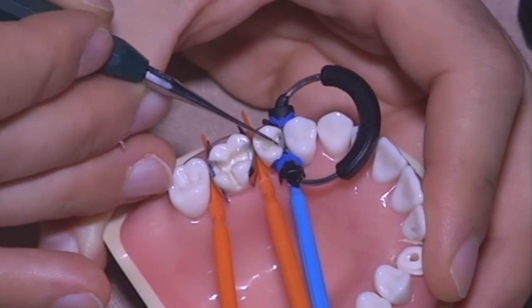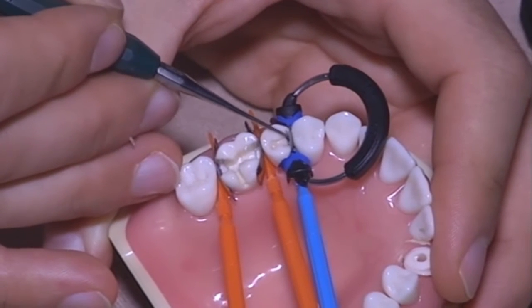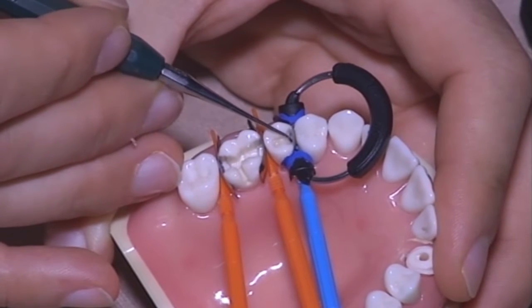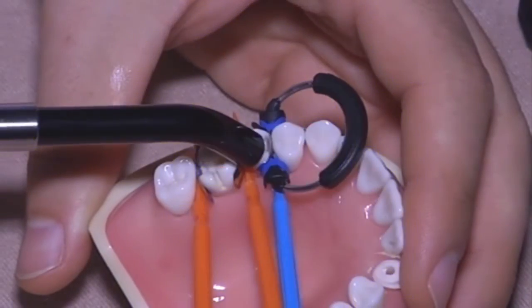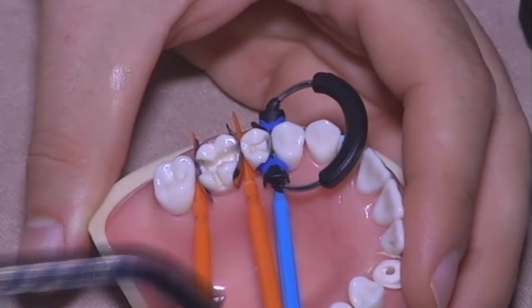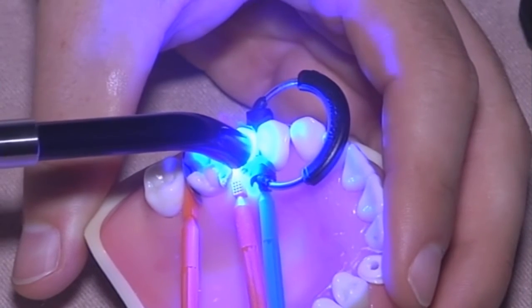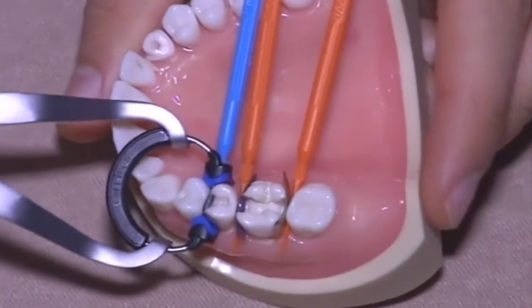I always use flowable composite as a first horizontal layer in cavities. Once you did it, I changed the program, I think. Okay. You light cure it, and then you can remove the ring.